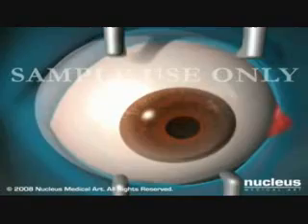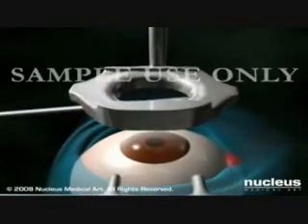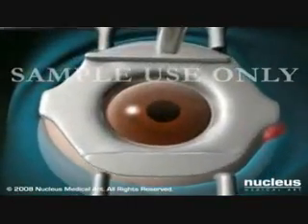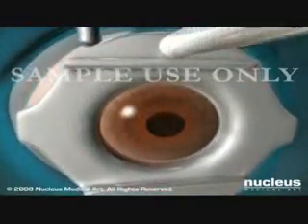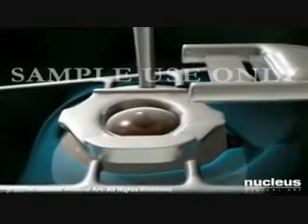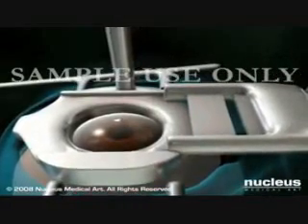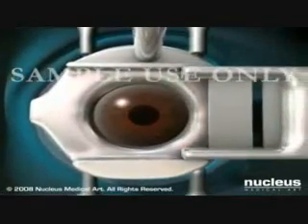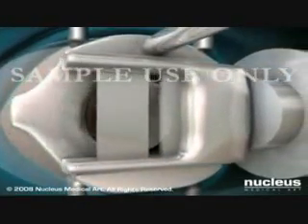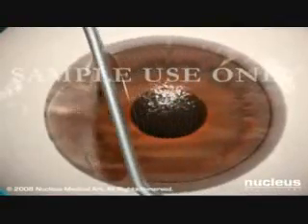Your doctor will use an instrument called a lid speculum to hold your eyelid open, and then place a ring on your eye that creates suction on the cornea. You may feel pressure and experience dimming of your vision at this point in the surgery. Once the ring is firmly in place, your doctor will attach a special device called a microkeratome to the suction ring. Using the blade on the microkeratome, your doctor will create a corneal flap by cutting approximately the outermost 20% of your cornea and lifting it carefully to one side.